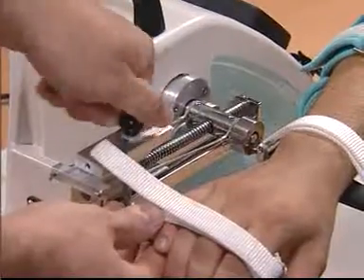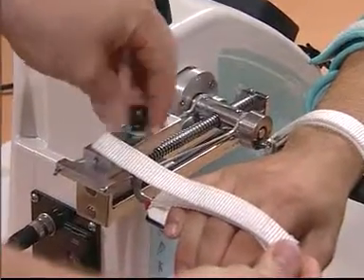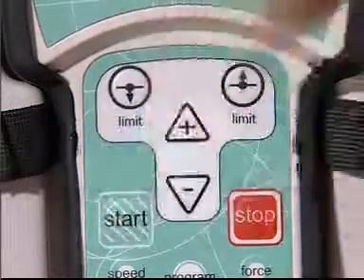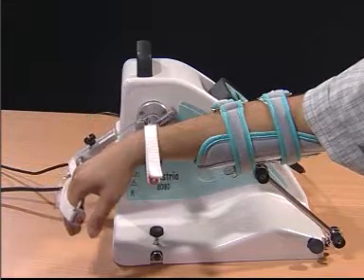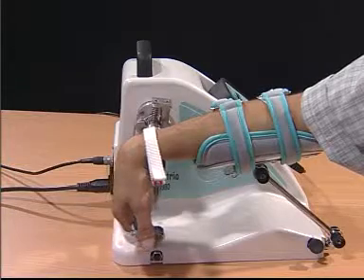Make the final adjustments so that no compression of the joints will occur, and start the movement. The motion will be 90 degrees of wrist flexion and MCP flexion to 50 degrees of wrist extension.